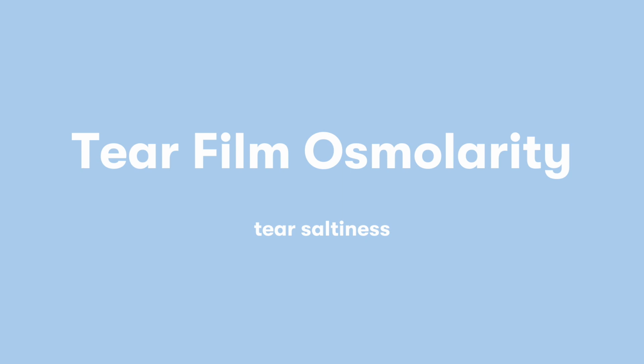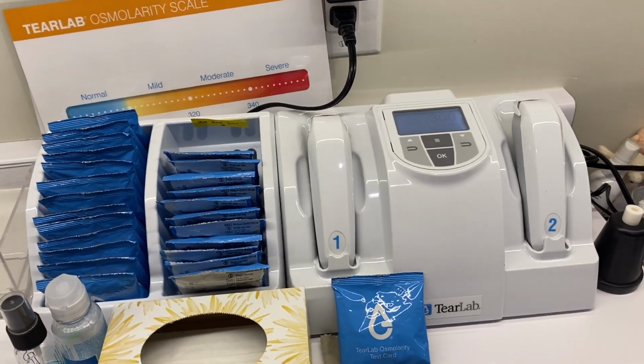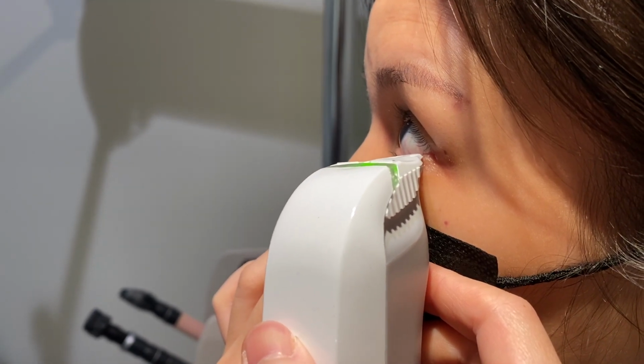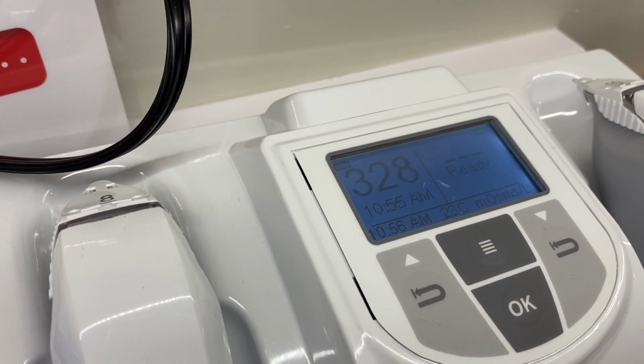The first test that we'll start off with is the tear film osmolarity, which is a measure of how salty your tears are. Increases in salt content can cause tear film imbalances, often seen in patients with dry eye. The device that we use here is called TearLab, a handheld device that is held up to the corner of your eye, taking a small sample of your tears. It then reads off your tear osmolarity score.